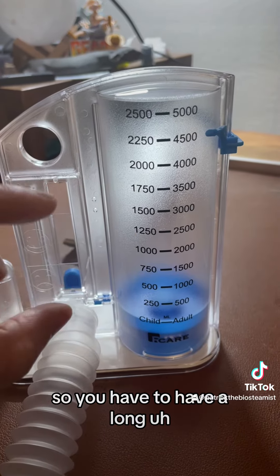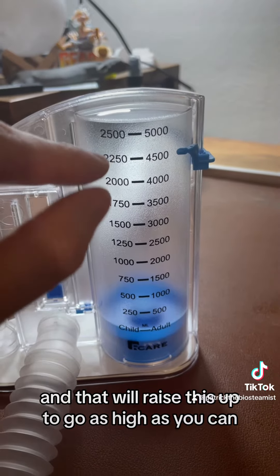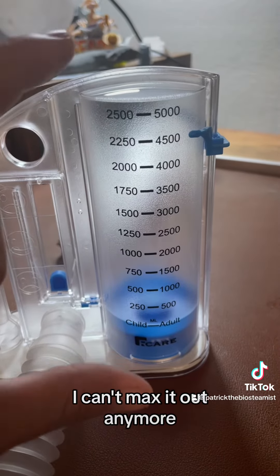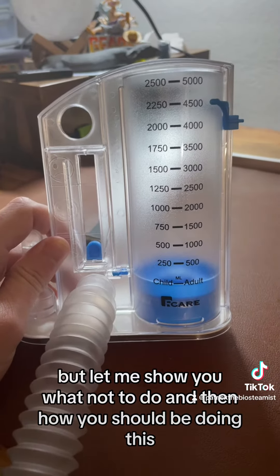You have to hold your breath at a consistent level and that will raise this up — go as high as you can. I used to be able to max these out but I can't anymore, so I'm going to have to train a little bit. Let me show you what not to do and then how you should be doing this.